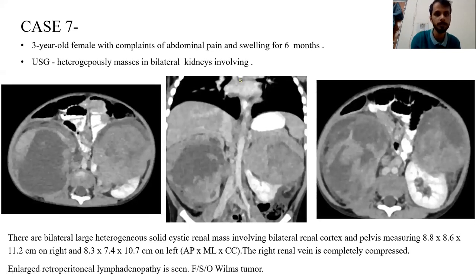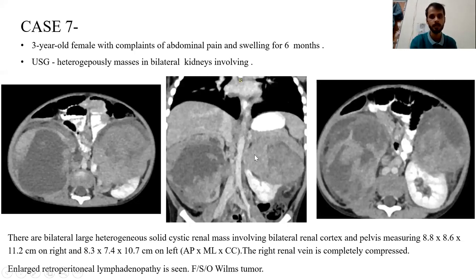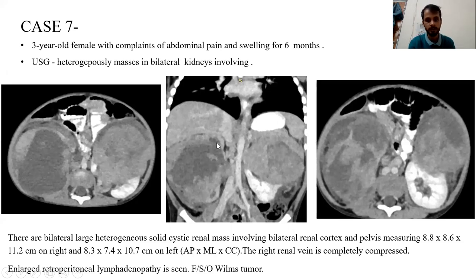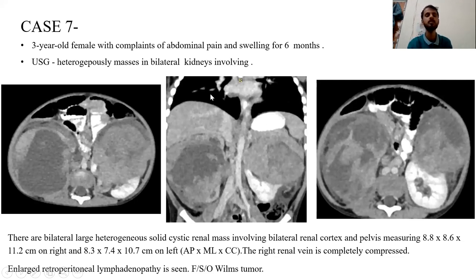Case 7: A 3-year-old boy with complaints of abdominal pain and swelling for the last six months. Ultrasound shows heterogeneous masses in bilateral kidneys. On axial and coronal CT images, both kidneys are replaced by large solid-cystic heterogeneous masses, approximately 10 x 8 x 9 cm in both kidneys. The right renal vein cannot be visualized, suggesting compression. Multiple enlarged retroperitoneal lymph nodes are also seen. This is a Wilms tumor.